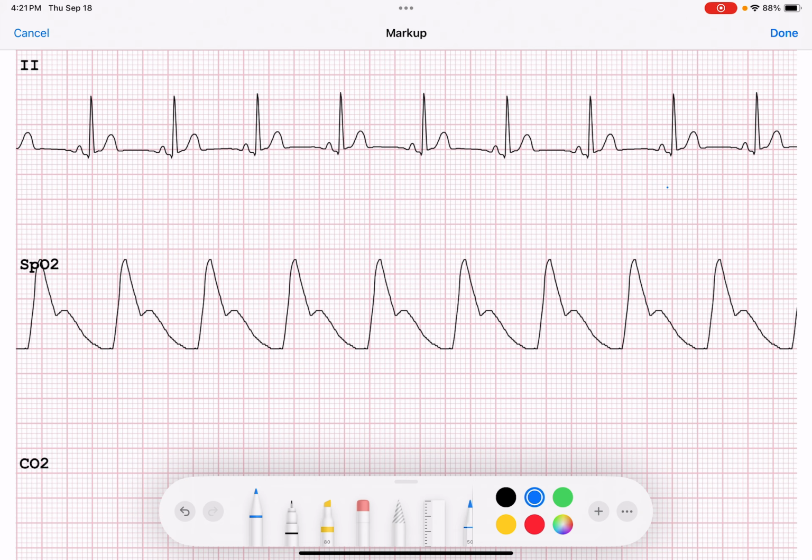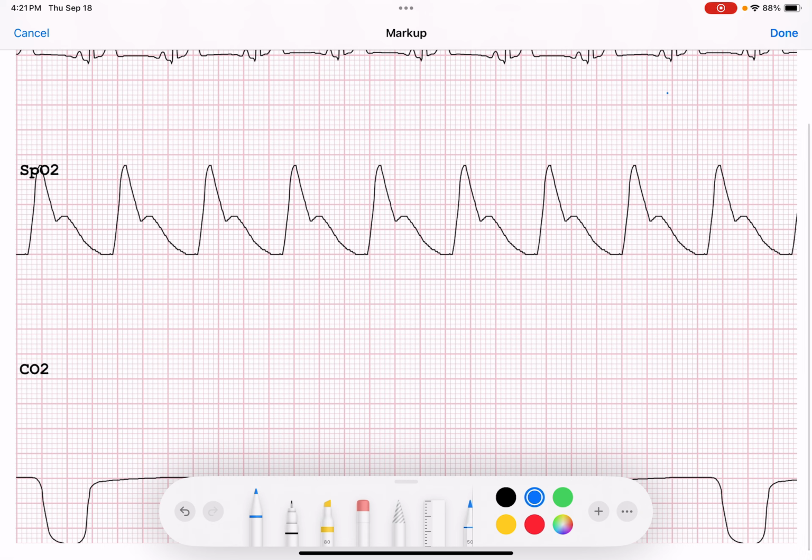So first things first, let's go ahead and break down the 5 components. You can see the ECG, obviously, right? The 5 components that you do want to see. First component: you want to make sure you identify all the waves. Don't mind my spelling here, guys. There you go, a little bit better. What does identify all the waves mean?